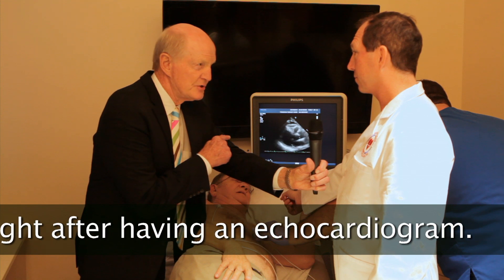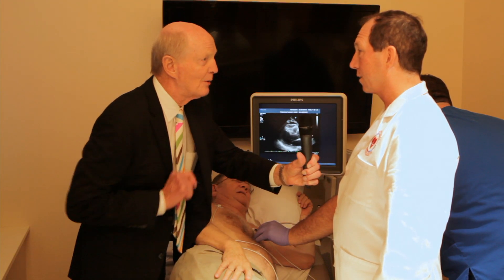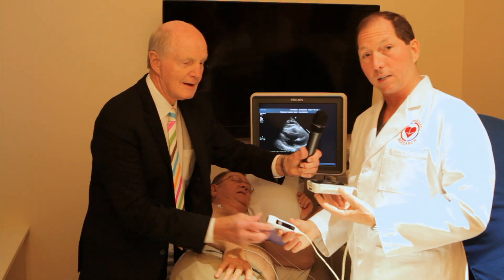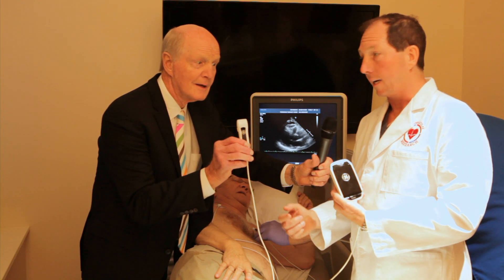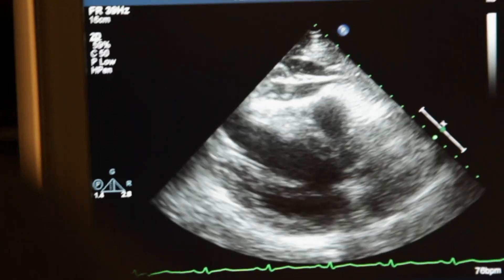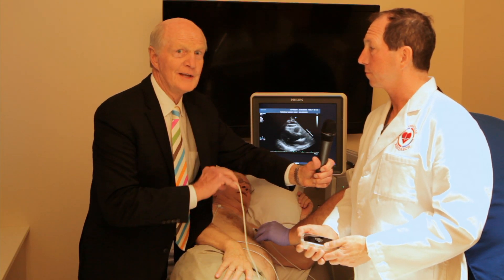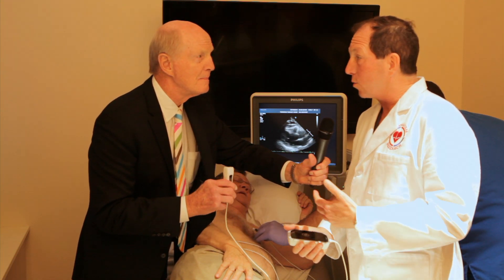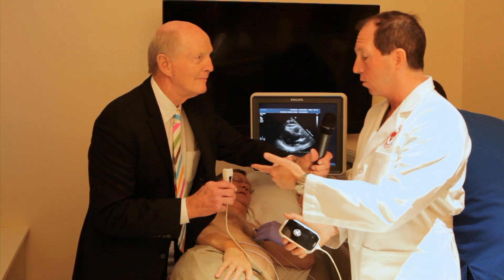Now Malcolm, this is a very expensive machine right here. What are the chances we could have this in every examining room when you come in to see your regular doctor? What's available? Well, it's actually available now. There is a handheld device about the size of a smartphone, and the probe, which is attached by a cable, allows us to take the very same images as an expensive unit in the hospital. So in the examining room, I could run this over my heart and look at the valves on the smartphone? That's right. Compared to a stethoscope, we get much more information — a much more detailed look at the heart with a handheld ultrasound.